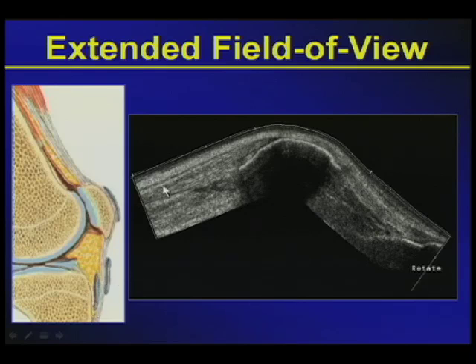The grayscale imaging shows you a bit of the pennate structure of the quadriceps muscle at the musculotendinous junction, into the fibrillar pattern of the distal quadriceps tendon, into the bone acoustic landmark of the patella, and back into a fibrillar pattern known as the patellar tendon, and into its final insertion into the anterior tibial tuberosity.